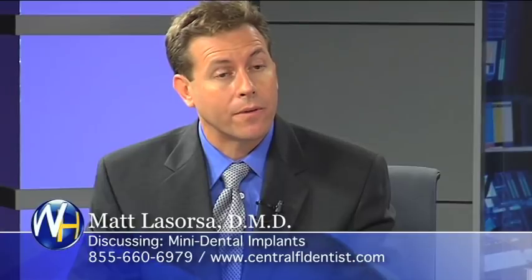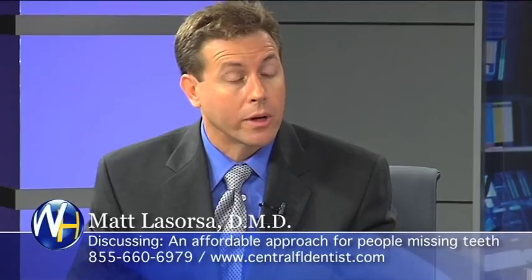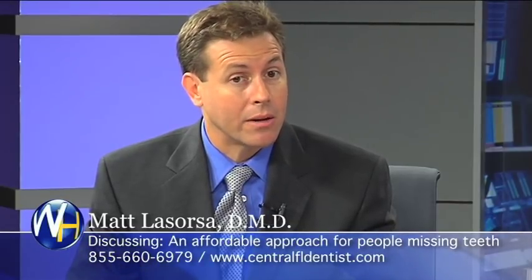So how many for fixed? Somebody wants a fixed set of teeth. How many dental implants for that? You're saying for mini implants. They don't want something that comes in and out, and I'm surprised to learn that with mini implants you could give somebody a fixed set. If we're going to use mini implants for it, I'd say 8 to 10.